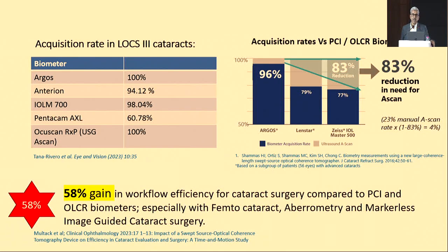So what this results in is a massive saving of time for us, because we don't need to use the immersion scan or the A-scan. And what studies have also shown is that if you're looking at the overall efficiency of your workflow in the OT, then it can give rise to a gain of almost 60% of time saved for us.